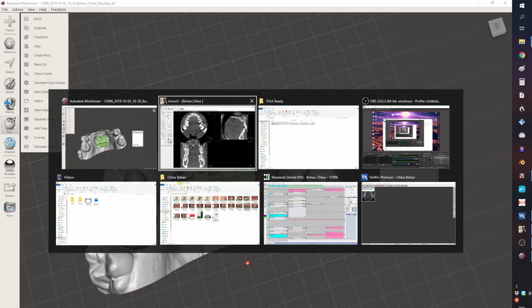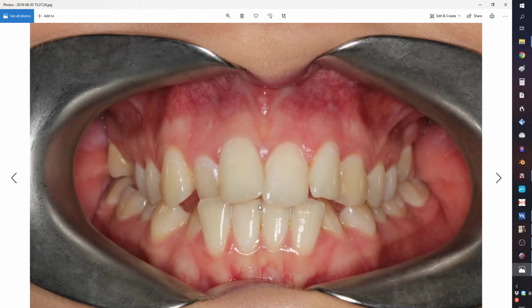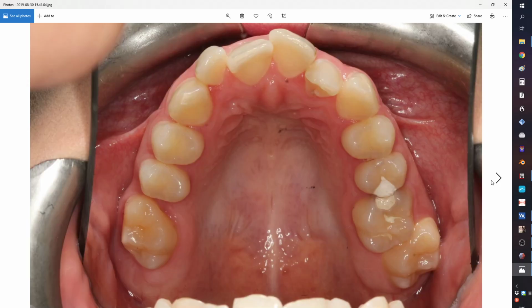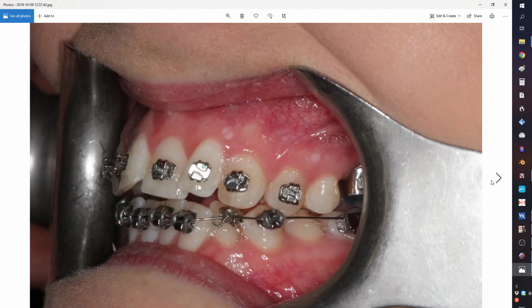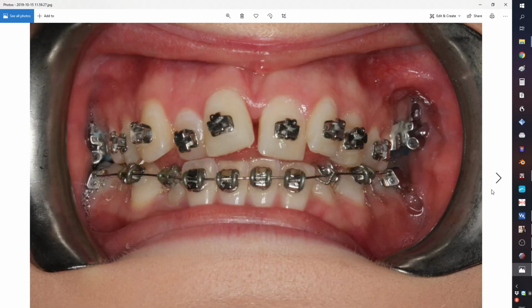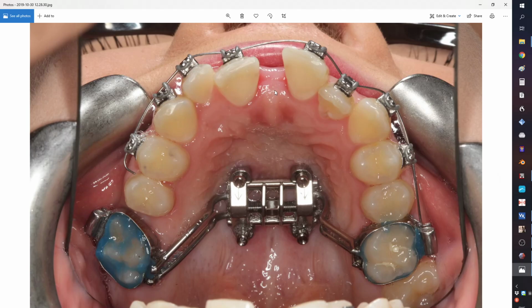The same patient has already had her appliance made, and I just want to show you that. She's a 20-year-old female. Tendency to a posterior crossbite. So that's the appliance fitted. And she's got a diastema, and this is at the end of expansion.